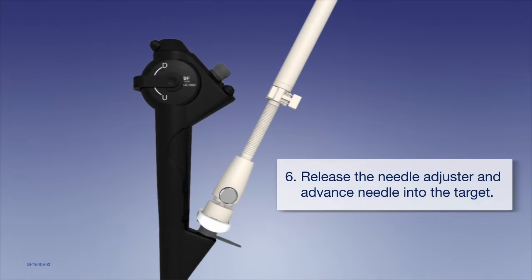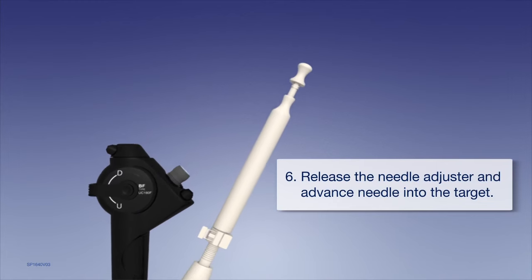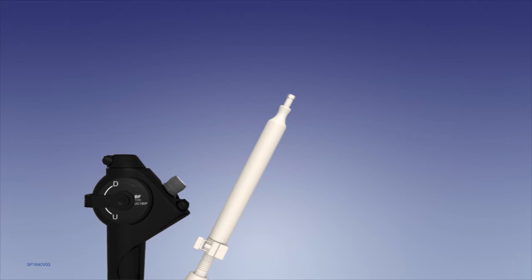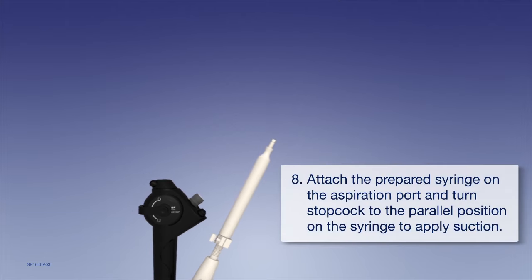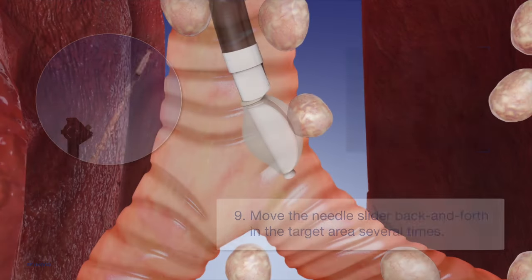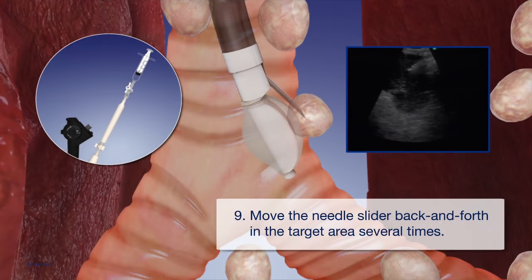Release the needle adjuster and advance the needle into the target. Remove the stylet and attach the prepared syringe on the aspiration port. Turn the stopcock on the syringe to the parallel position to apply suction. Move the needle slider back and forth in the target area several times.